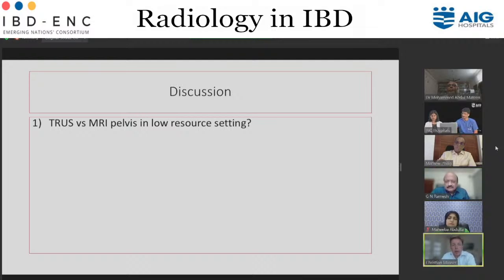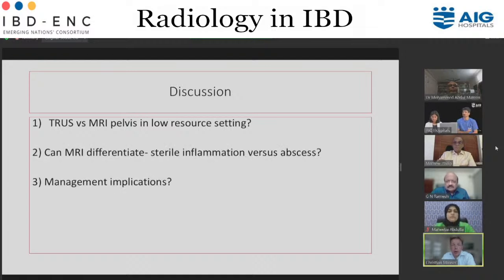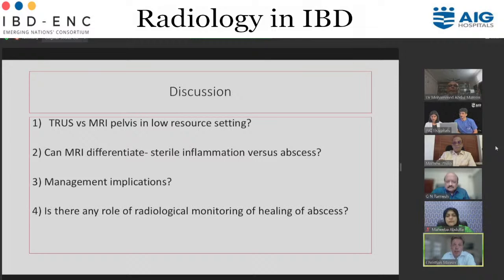For patients presenting with acute perineal pain, the perineal ultrasound is good for the first scan because it's quick and easy to do. If you do not find the answer when you do the transperineal ultrasound, then we most times go for MRI, because for follow-ups, if you are looking for fistulas, it's a bit easier to follow up. But if you are very experienced in transrectal ultrasound, the clinical trials suggest that it's almost as sensitive and specific as MRI. So if you have transrectal ultrasound available and you are an expert, it's for sure a very good method. We personally do perineal ultrasound for acute things and then send our patients for MRI if we don't get a conclusive answer by the transperineal ultrasound. Okay, thank you very much.